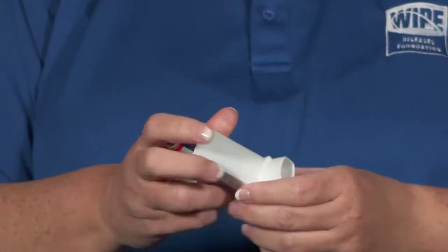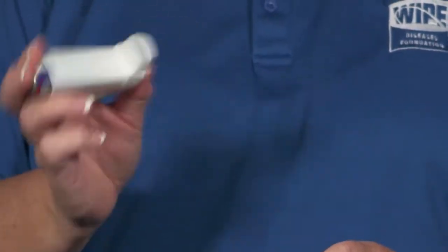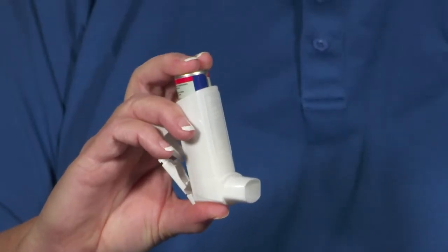All MDIs must be primed before the first use and if they have not been used for a while. To prime the MDI, remove the dust cover and shake the device for at least 5 seconds. Then hold the mouthpiece away from you and push the top of the canister down. The number of times to repeat this maneuver varies depending on the medication in the device.